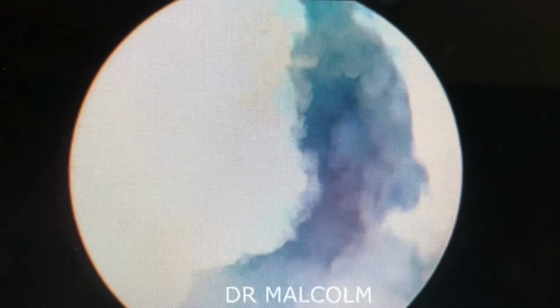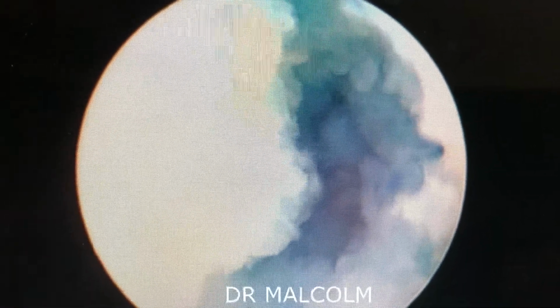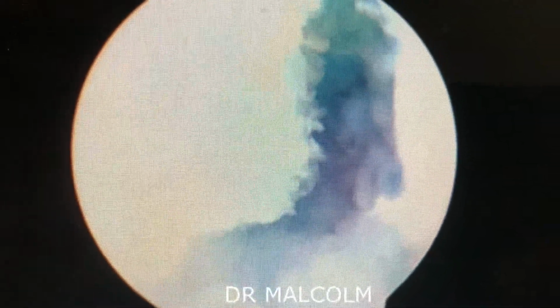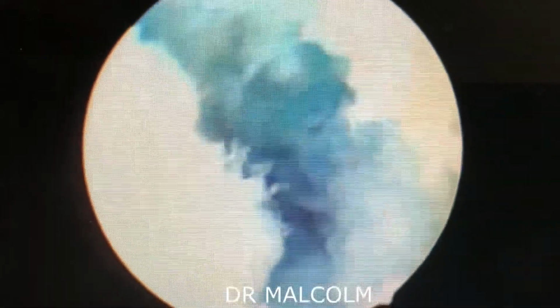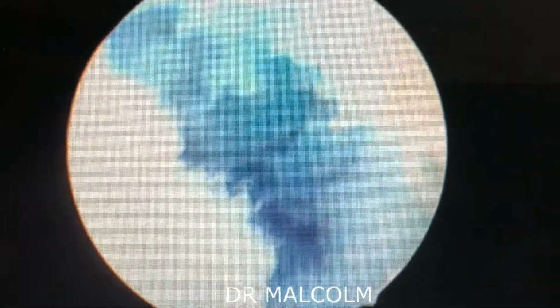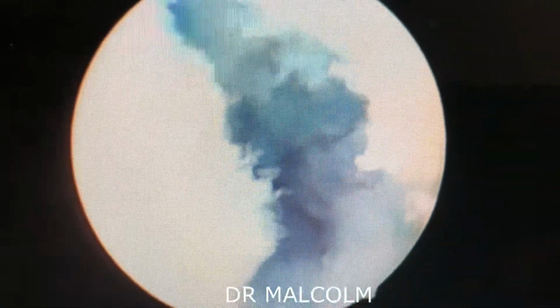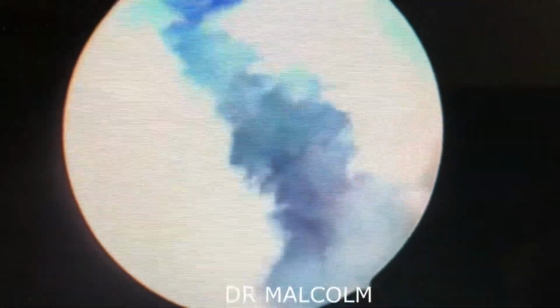One can clearly see the PLL, the neural tissues, the tear, the amount of material in the pockets around the tear, the complexity of the tear. Not only is it horizontal, but it has vertical ramifications.